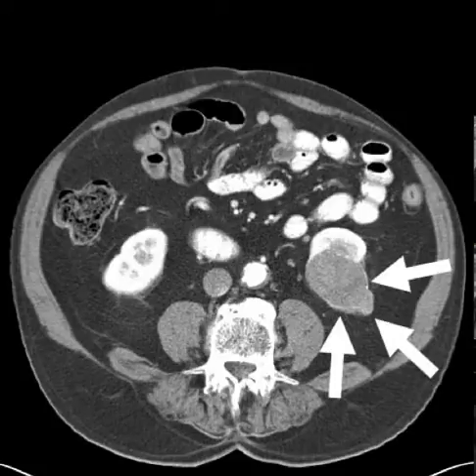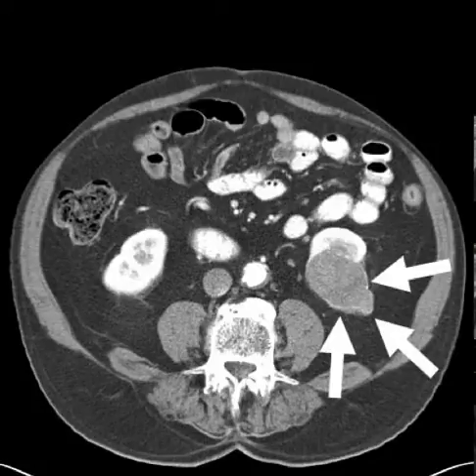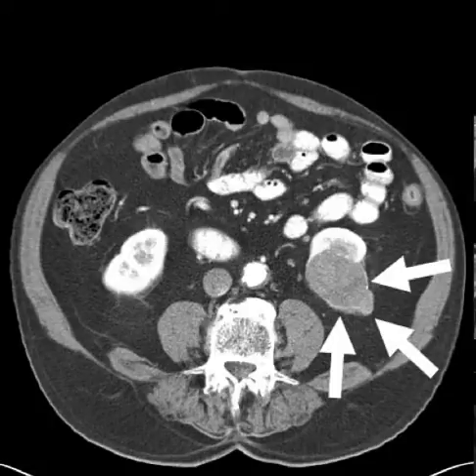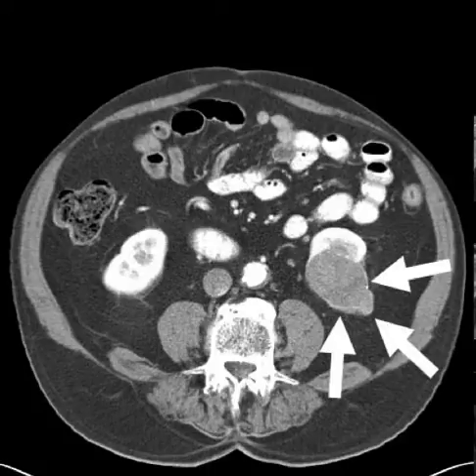That being said, we have three main ones that we're going to be assessing, and that's the clear cell, the papillary, and the chromophobe. There are more than this, but we need to know these three because they're going to be the main ones and the ones that we're going to find most commonly when we're assessing CTs. In terms of the clear cell carcinoma, we know that we're going to be able to see it better in the nephrographic phase. And as we said before, the nephrographic phase is going to be the most sensitive phase.